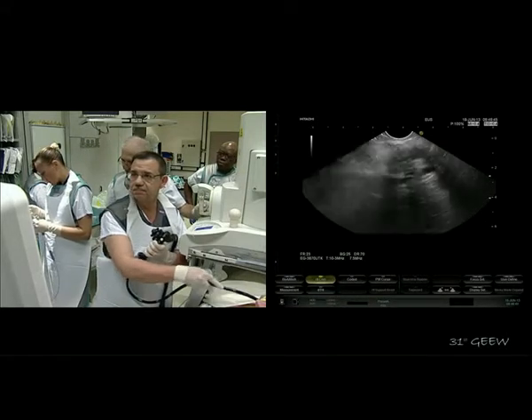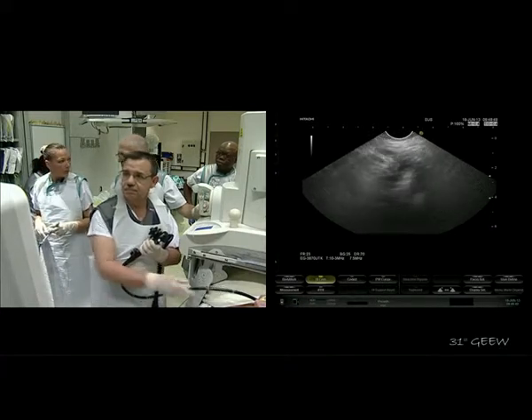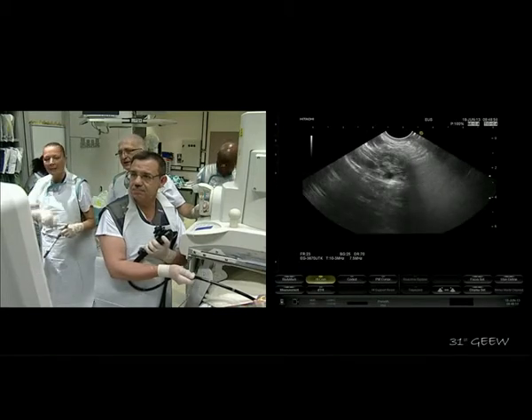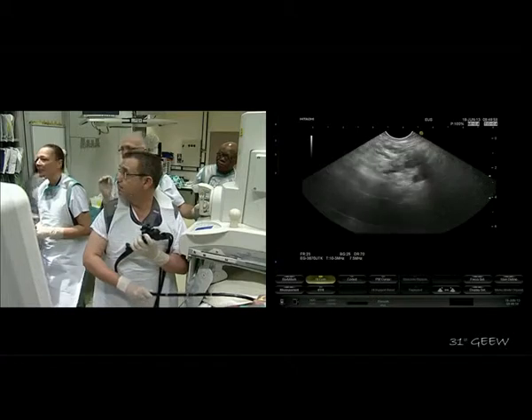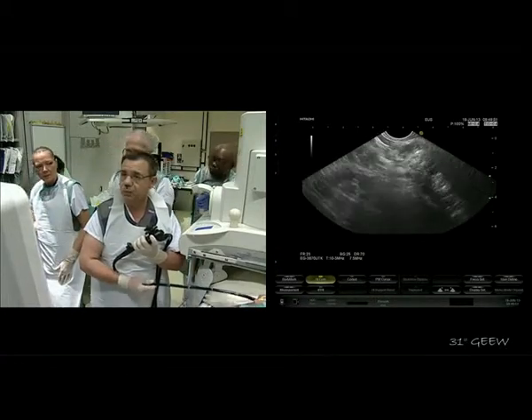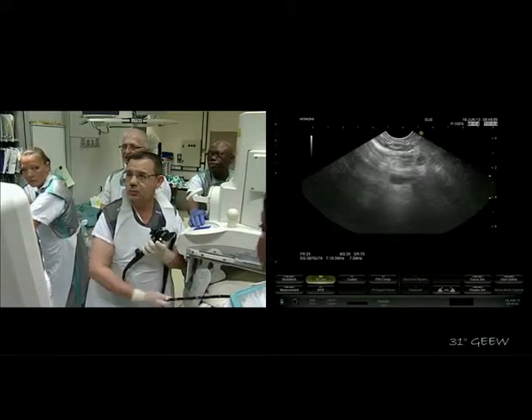I don't know if we had a problem with the small cystotome here, maybe with a connection with electrocautery. But why we like this cystotome is that you can enter the duct without applying too much pressure. And this is the key.